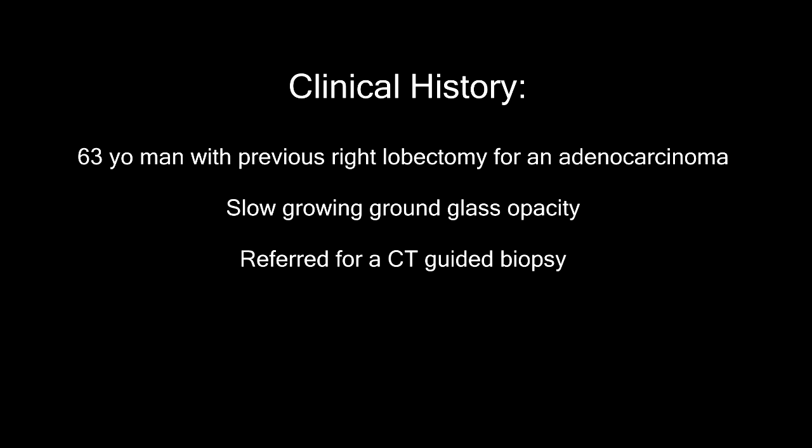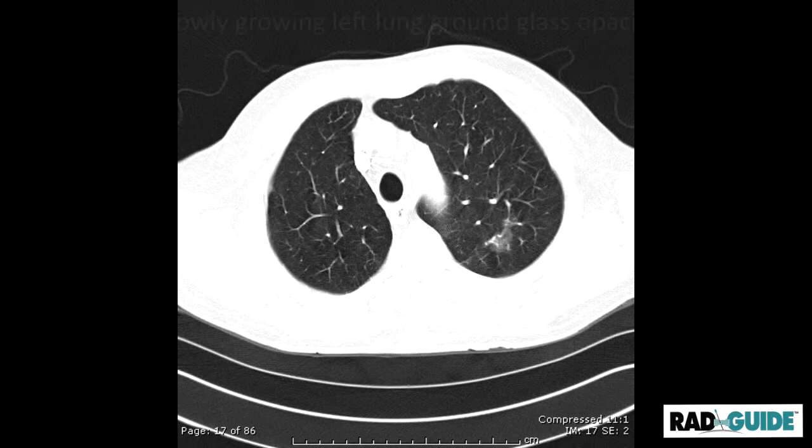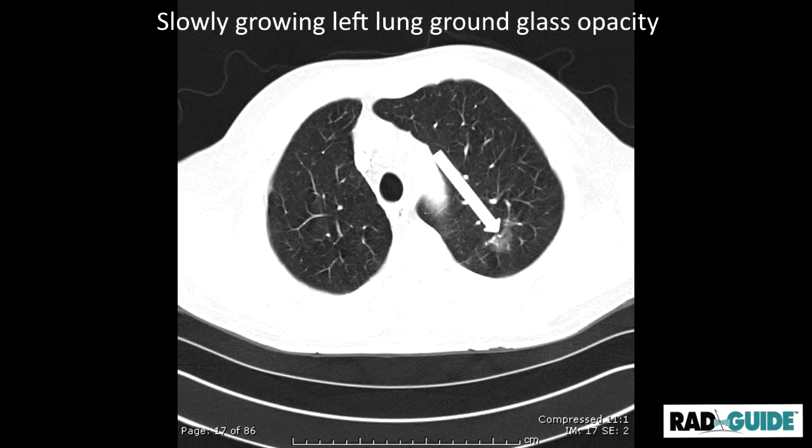He was followed for a very slow growing ground glass opacity of the left upper lobe, and the physician decided to perform a biopsy, so he was referred to us in that context. The CT image shows a very small ground glass opacity in the left upper lobe.